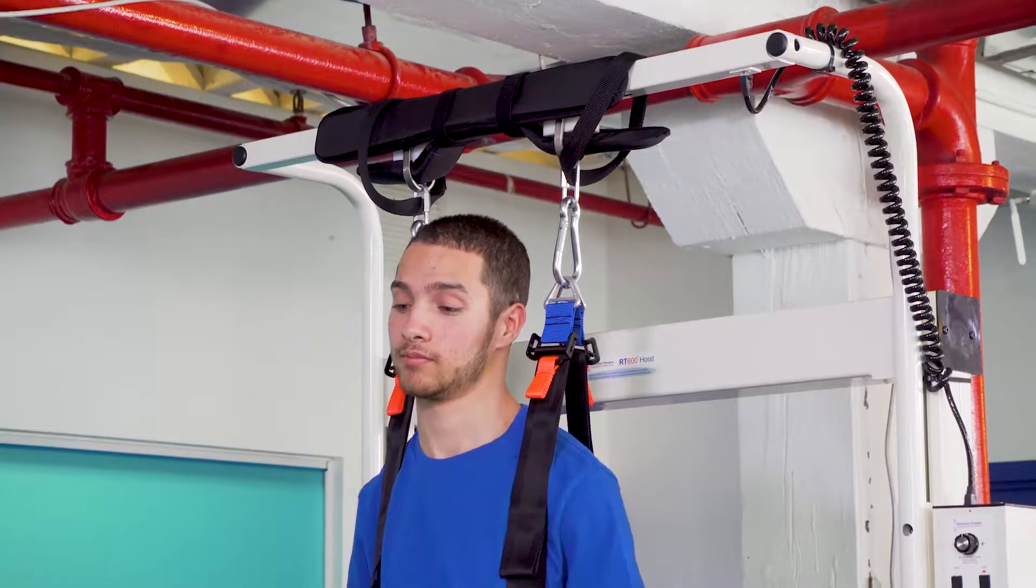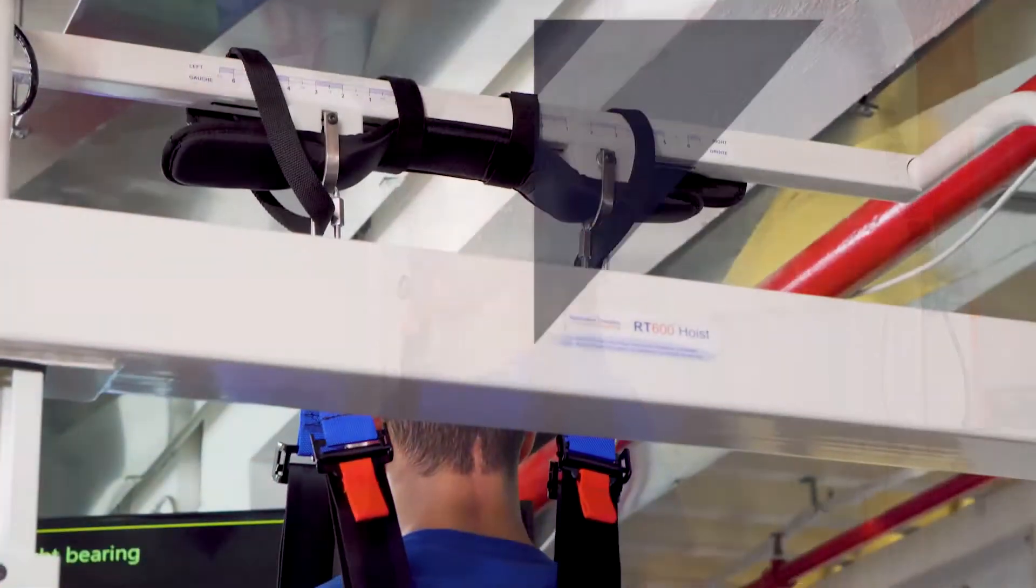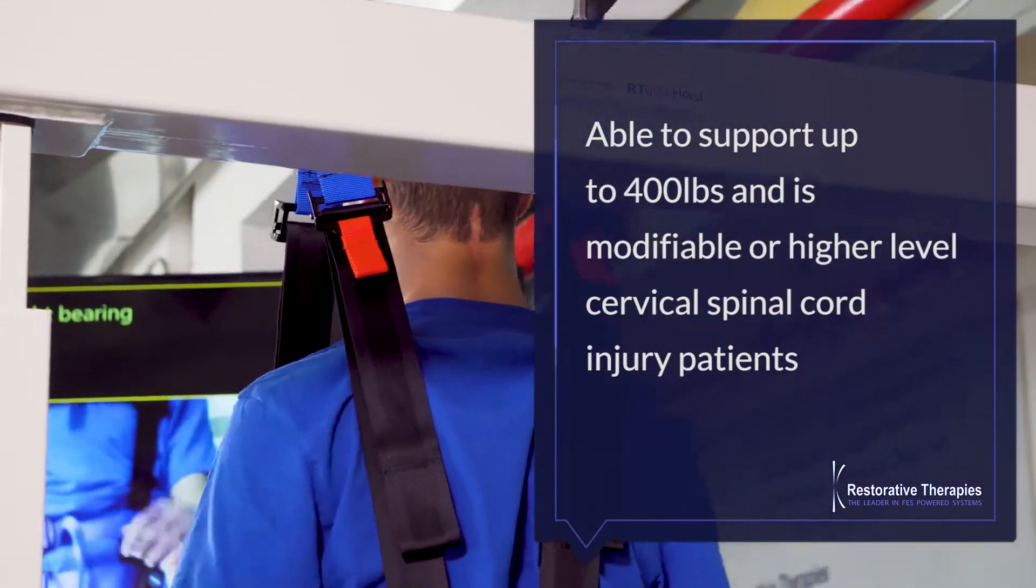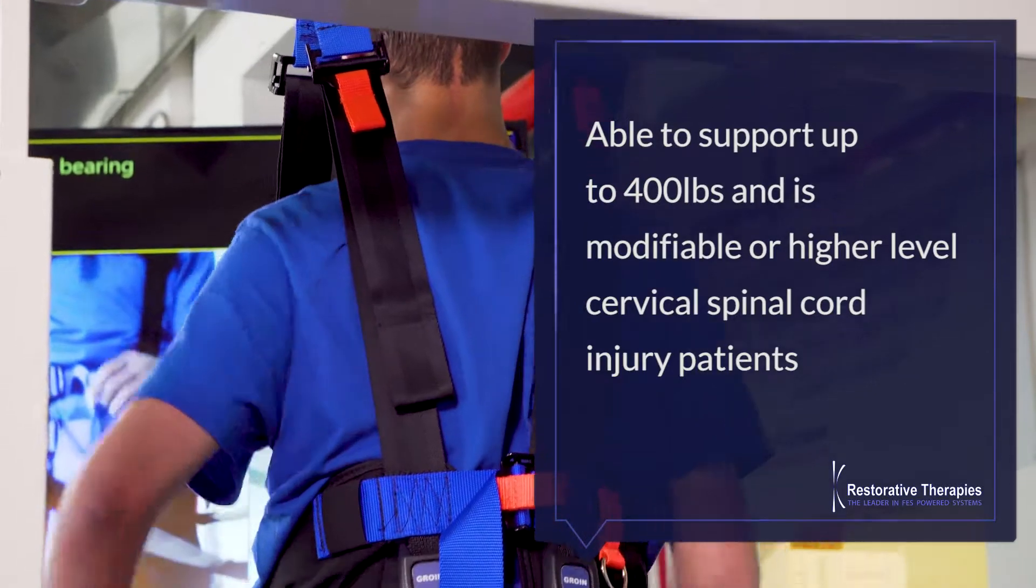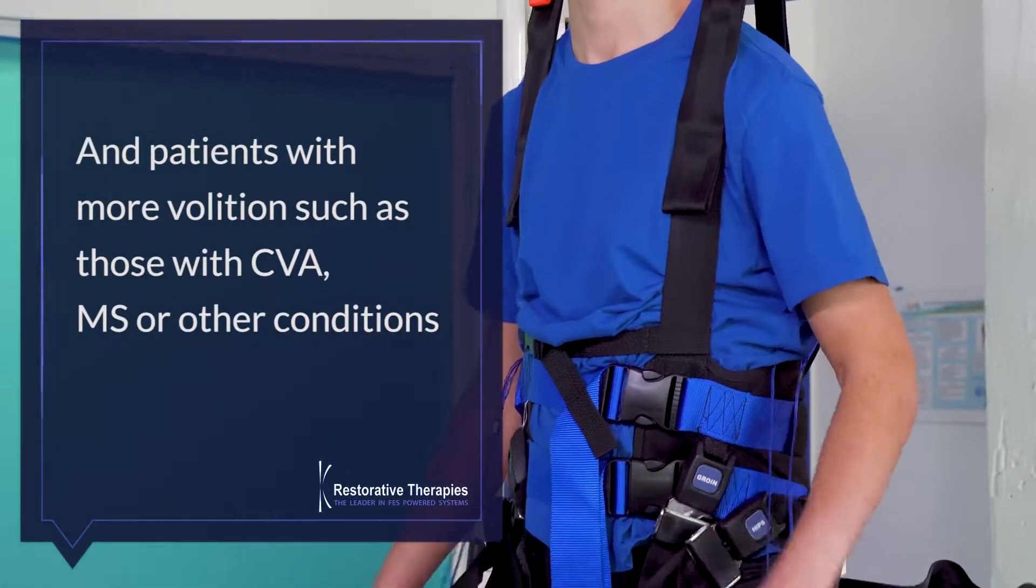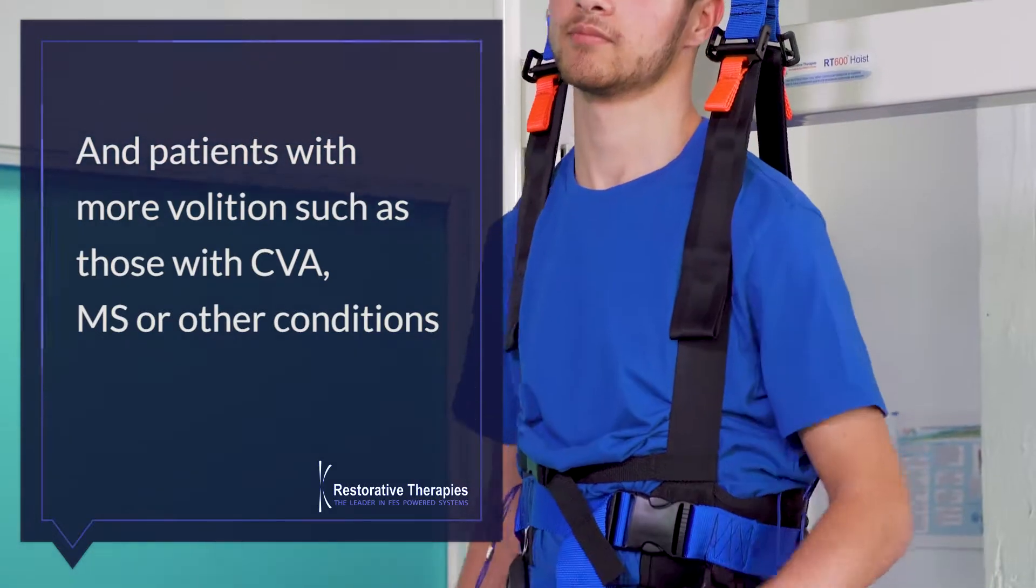Parker is secured using this harness and hoist, which is able to support up to 400 pounds and is modifiable for higher level cervical spinal cord injury patients and patients with more volition, such as those with CVA, MS, or other conditions.